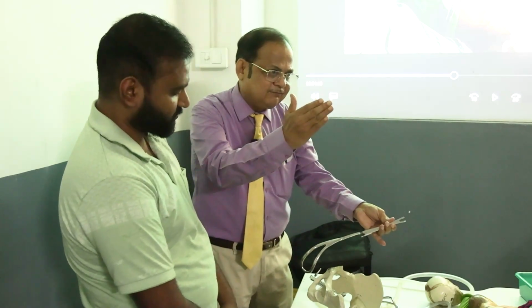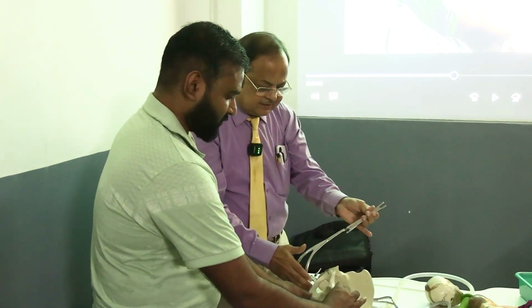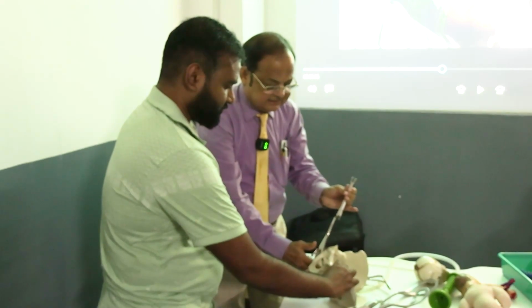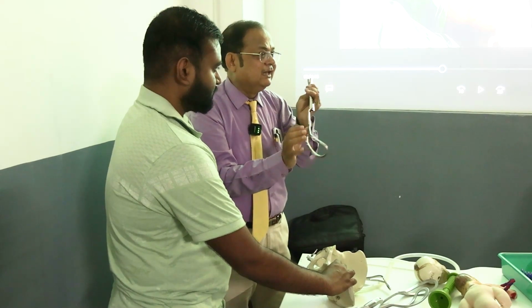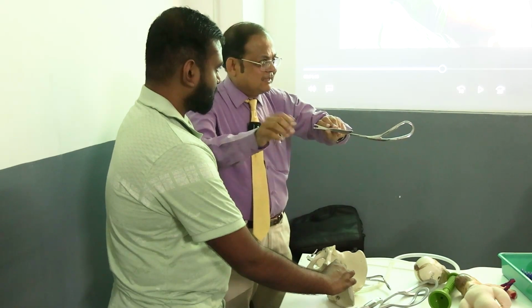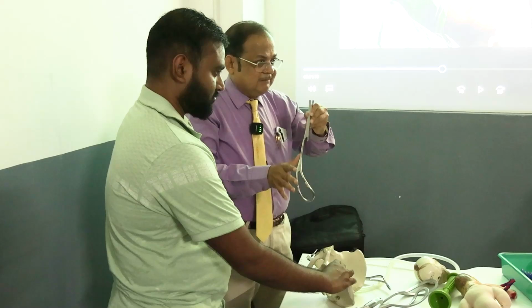And keep my four fingers inside. Fix correct. Four fingers like this. And give the pressure over the heel, not like this. It is not like stirring; you give pressure here.